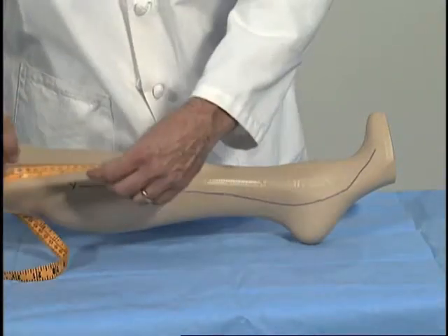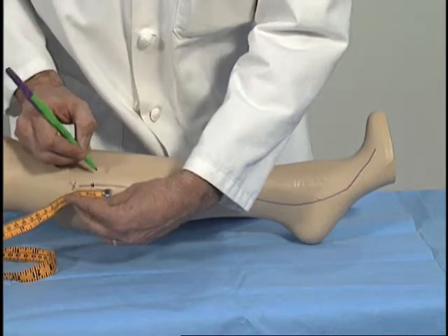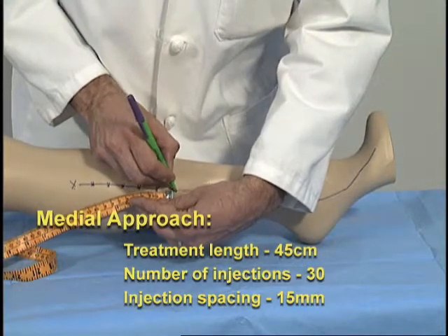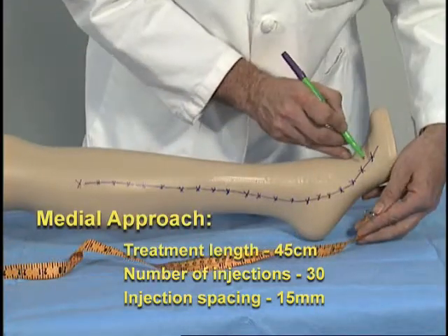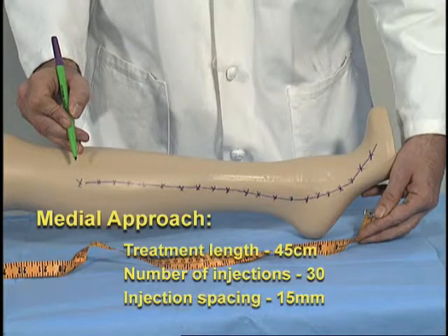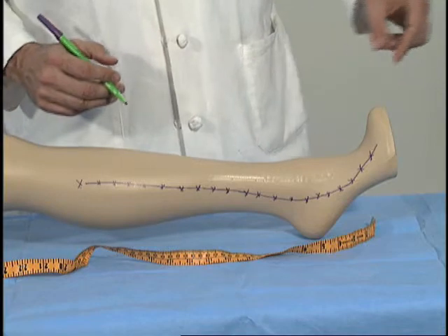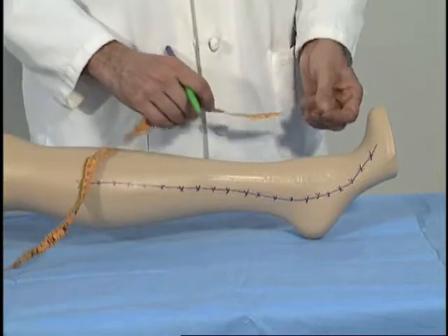Therefore, if we're treating at 15 millimeter intervals on the medial aspect of the leg, a treatment length of approximately 45 centimeters is going to consume 30 of our injections. Again, 30 injection sites on the medial aspect of the leg at a distribution of 15 millimeters apart. That only leaves us 10 injection sites on the anterior compartment. The maximum space that can be used in this trial is 2 centimeter spacing.